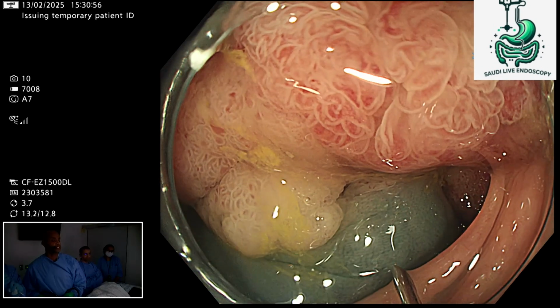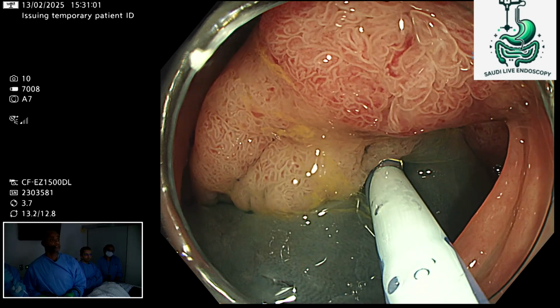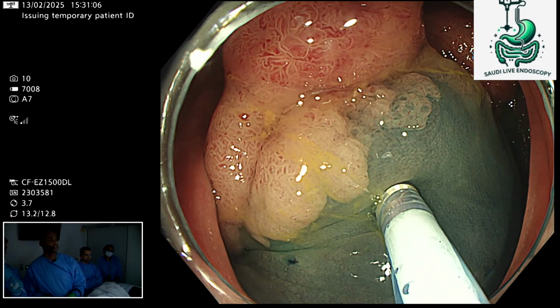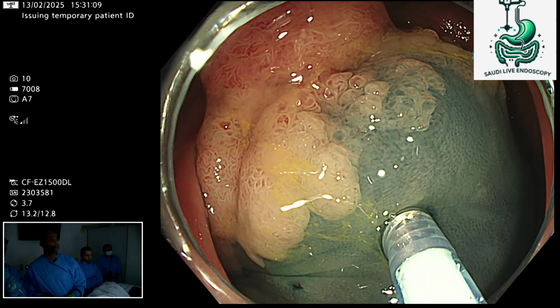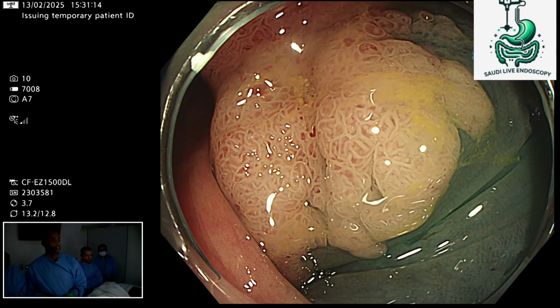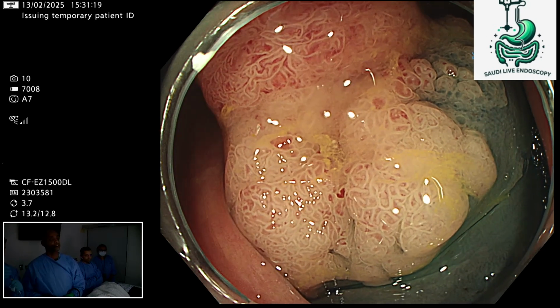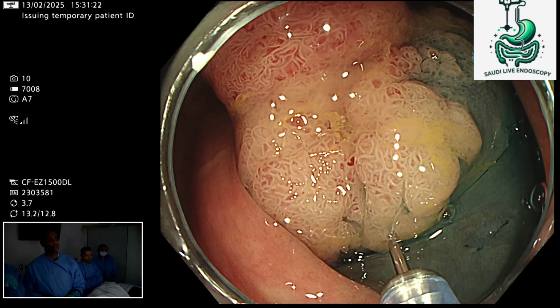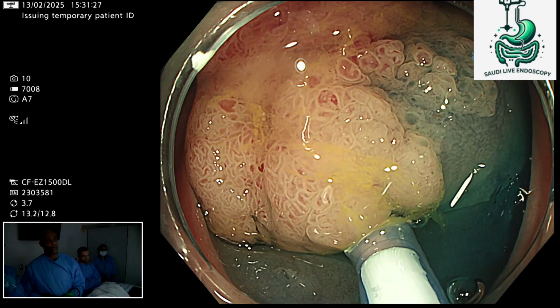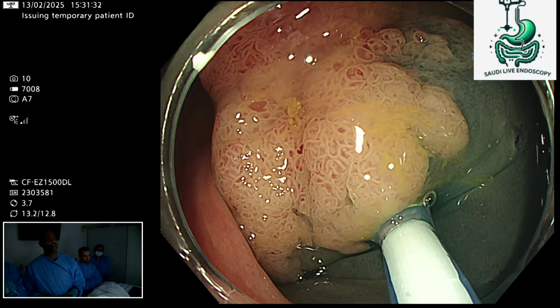And I think in this situation, a right hemi would be a good option. Quick injection, keep injecting. Stop. There is no limit for the injection. And you continue injecting until it is lifted, right? Yes. And it should lift because it's a granular lesion. There's no features of disruption of the surface or the vascular pattern, so we're not anticipating any non-lifting feature.